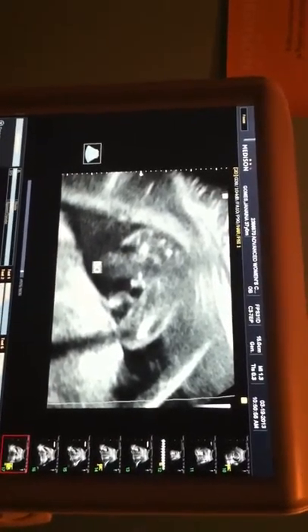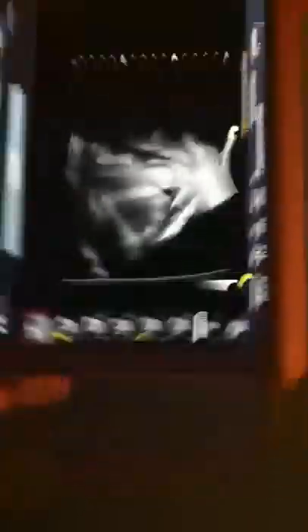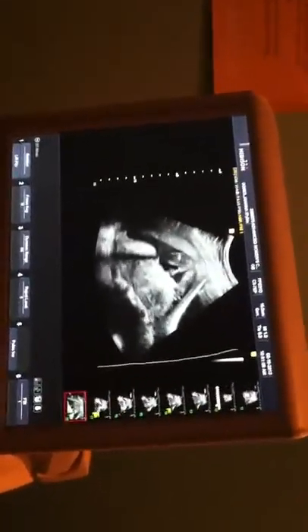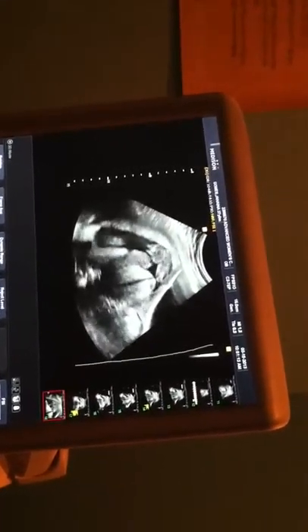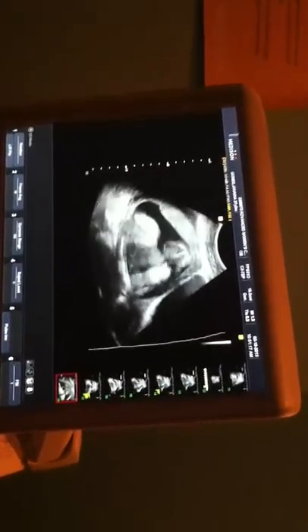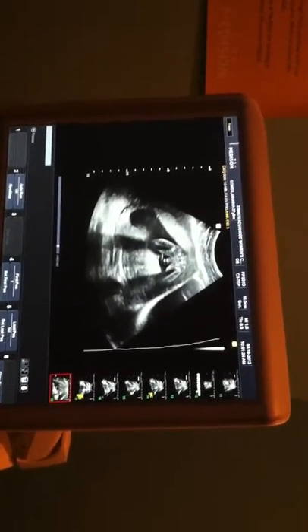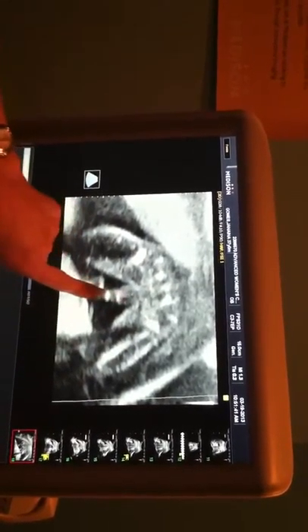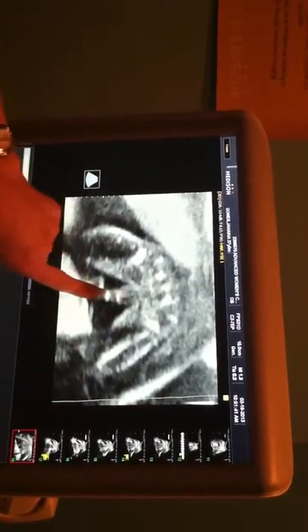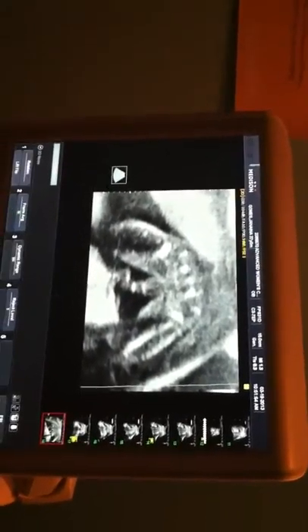We'll try to get another one too, but let's get this one — that's a good one. She's right there standing up. You can see it there, but it runs into the cord. That would be a perfect picture of that cord. That was pretty good. Let's see if we got any other ones in there that were any better. There it is — that's the one. Legs wide open in there, it is standing right there. This is cord here, but from here back is boy part.